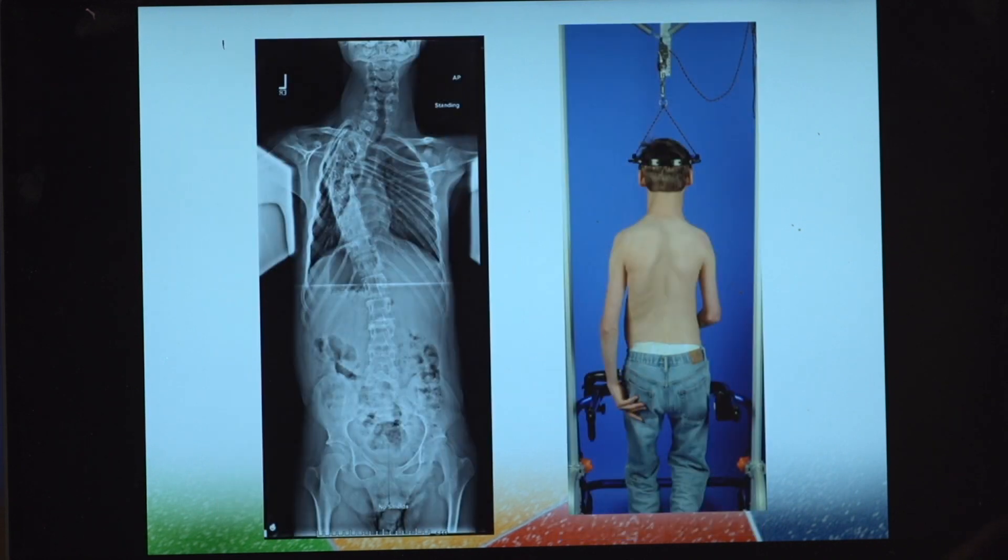This is the patient in halo gravity traction. This patient was taken to 80% of their body weight in traction. What you can see here is the significant clinical and radiographic improvements that were gained in traction.